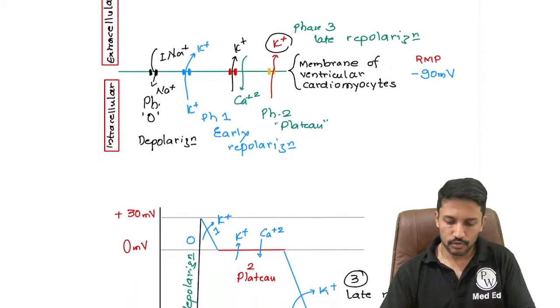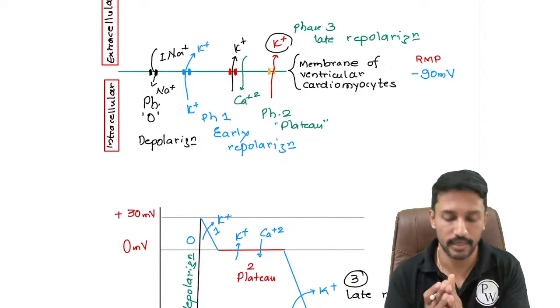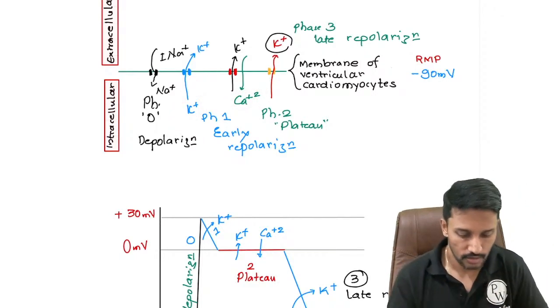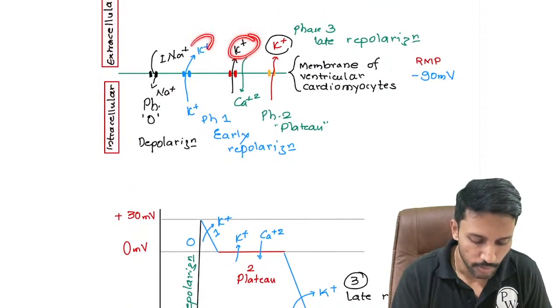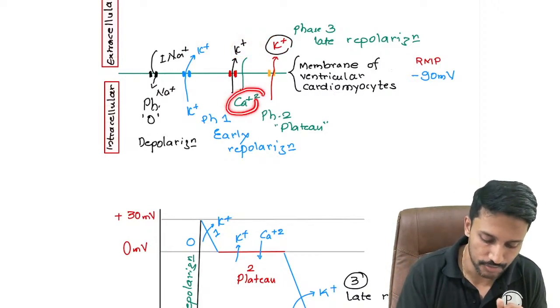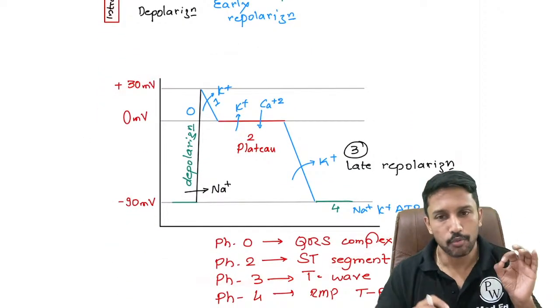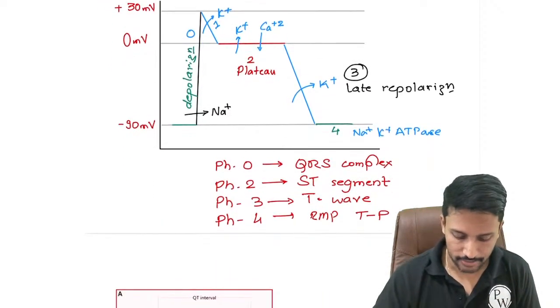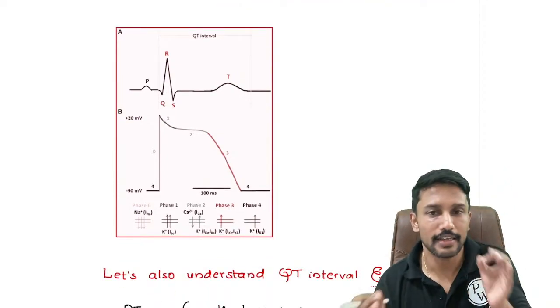Clear? So when it comes to the functioning of the cardiac myocytes, now we can clearly understand that the most important electrolytes are going to be calcium and potassium. Potassium is the single most important electrolyte, because for me to repolarize the ventricular myocardial cells, I need to keep pumping the potassium out, right? So if I have any abnormalities of calcium or potassium, I may not be able to carry out this normal depolarization and repolarization act of the ventricular myocardium, and that can reflect on the ECG. So with this backdrop, we will start understanding the ECG abnormalities in electrolyte imbalances, right?